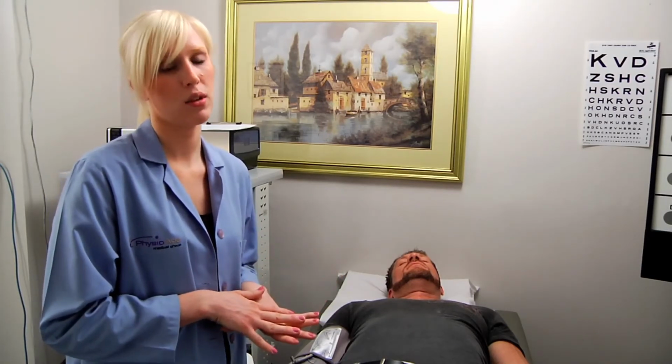One thing I wanted to mention is that if the patient wasn't talking during the skin elasticity test and they seemed pretty relaxed, you can count that as 5 minutes of rest time. So you don't have to leave the room for 10 whole minutes. If they were talking to you and chatting, you can't count it as 5 minutes.